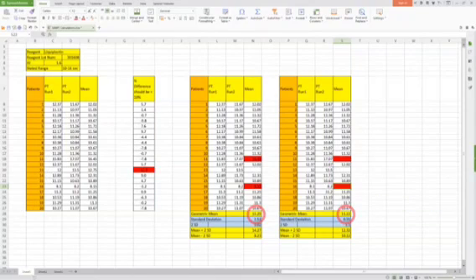As is evident, the MNPT has been changed from 11.25 as in the previous calculation to 11.22 now. Since the standard deviation has also changed, the ranges also change accordingly. This final range, 12.32 to 10.12, will serve as the biological reference range for this lot of thromboplastin.